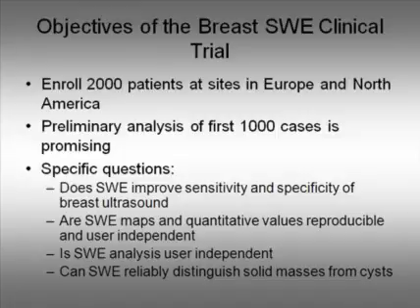The specific questions of the trial were to look at whether shear wave elastography can improve sensitivity and specificity. It also looked at whether the shear wave elastogram maps and values were reproducible and user independent, and if it could also reliably distinguish solid masses from cysts.